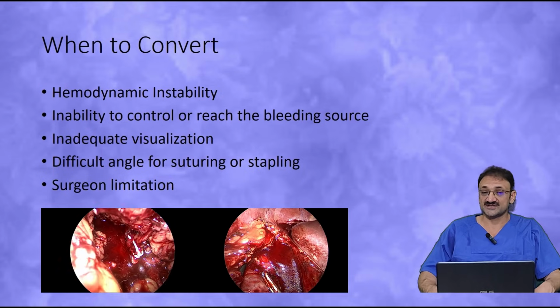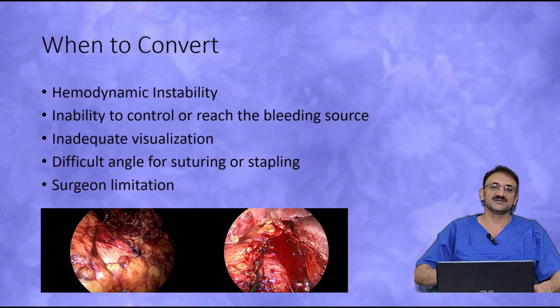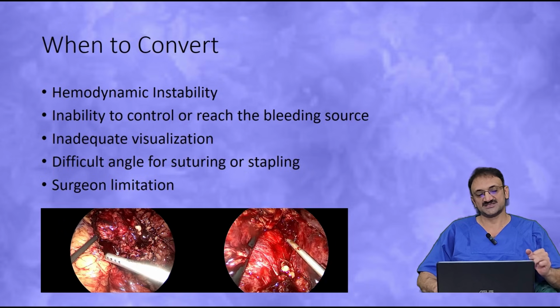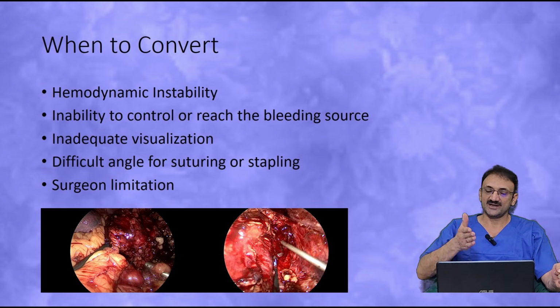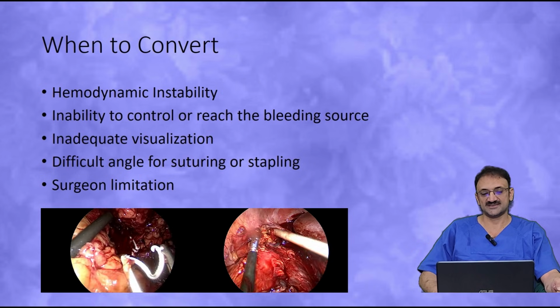And of course, during the conversion, you must not just leave everything and start opening the patient. One hand of yours or your assistant must be on that vascular structure which is bleeding, so that it is compressed. One must be holding it and you will be opening it. So conversion must be perfect.